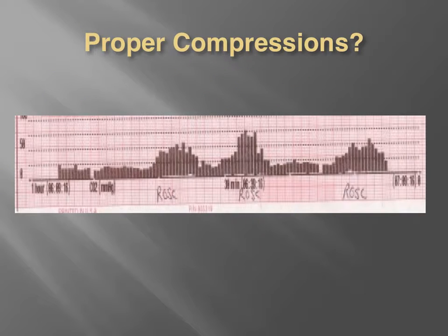Here's also another good illustration from EMS Capnography blogspot.com, and this one is reflective of our trend report, which I just mentioned. Each one of these little hashes here is every so many moments, and I don't know exactly which one this is referring to, because you can do trends for 1, 3, and 5 minutes or what have you based on the monitor. But you can see over time that this is a cardiac arrest where they're working, and then they get this spike in end tidal CO2, and then they lose the patient, and then they get a spike again, so on and so forth.